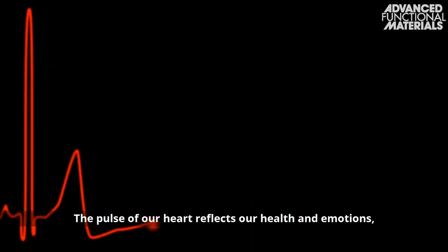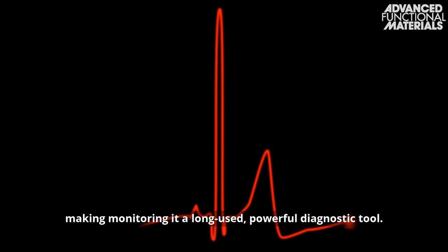The pulse of our heart reflects our health and emotions, making monitoring it a long-used, powerful diagnostic tool.